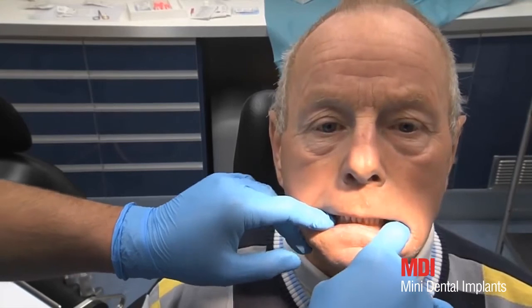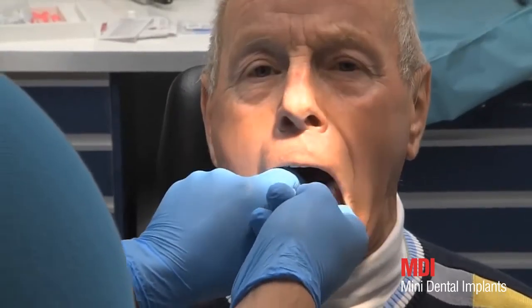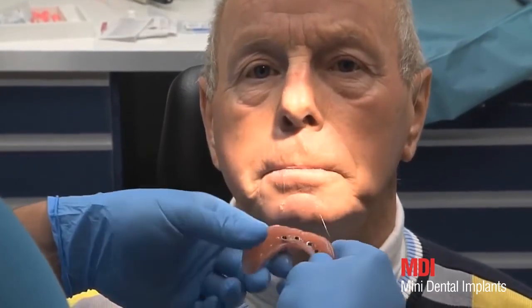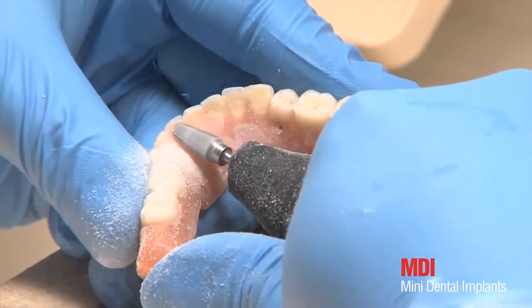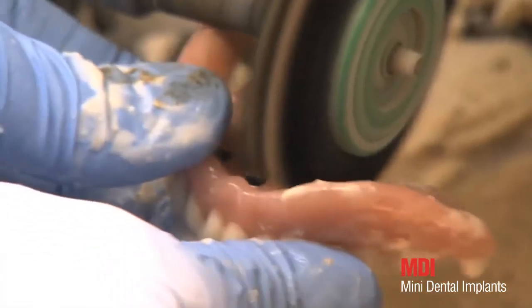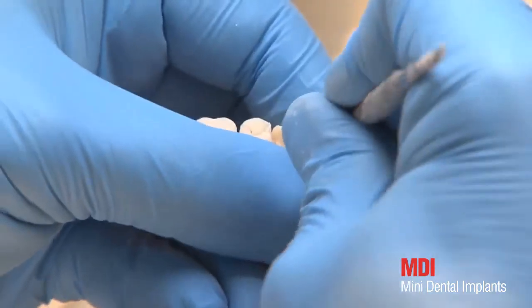The patient is requested to bite moderately for six to eight minutes. Correct occlusion is checked again. After removal of the prosthesis, the metal housings are secured in the desired position. Excess resin is removed and the prosthesis is polished. The edges of the housings and the O-rings should be visible.